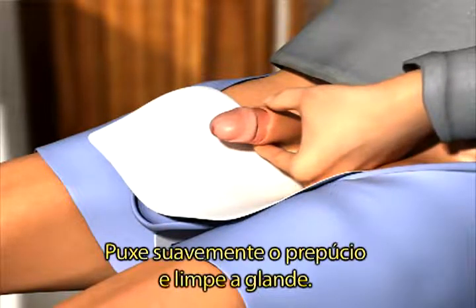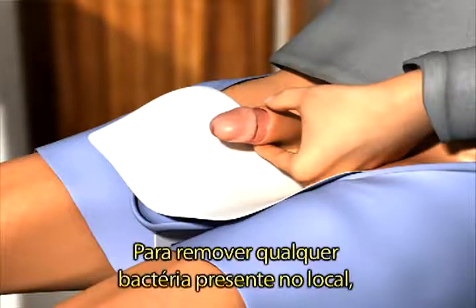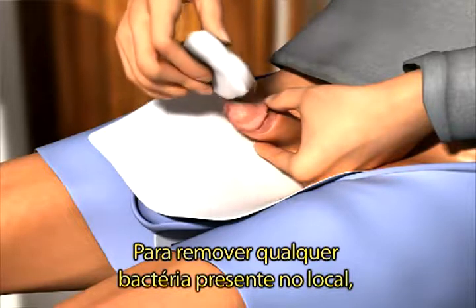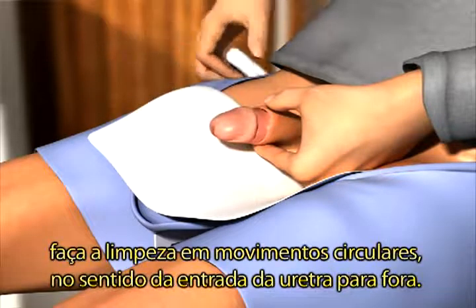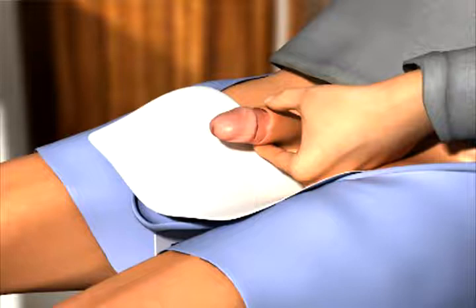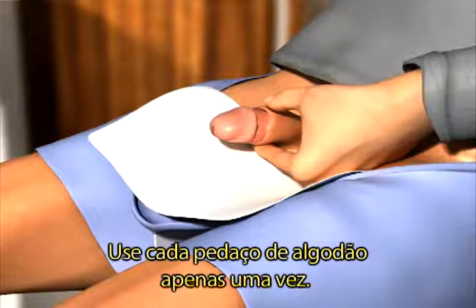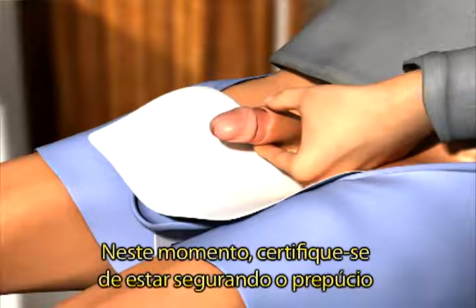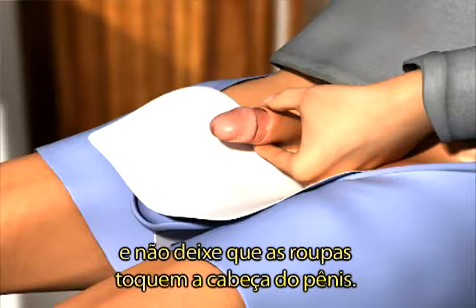Gently pull the foreskin back and wash the head of the penis. To remove any bacteria that might be present at the opening of the urethra, you should wash in a circular motion starting at the urethra and working outward. Use each cotton wool pad only once. From this point, make sure that you keep holding the foreskin back and that you do not touch the head of your penis with your clothes.